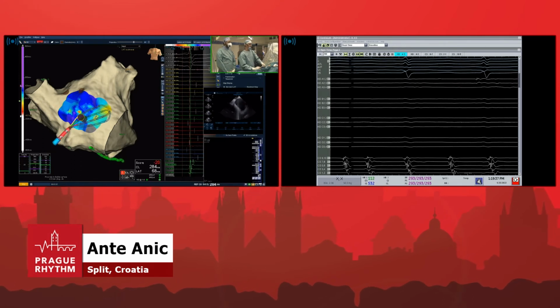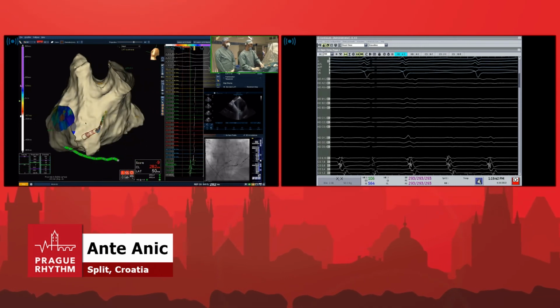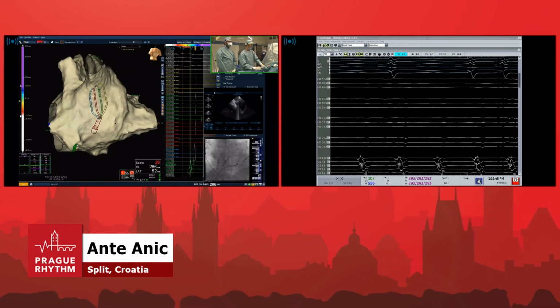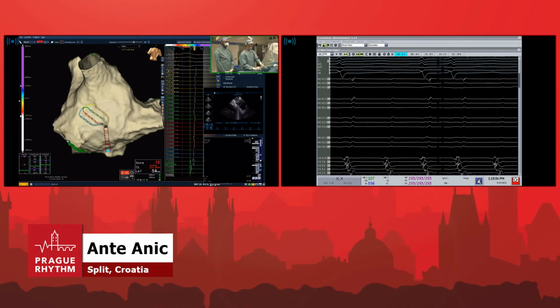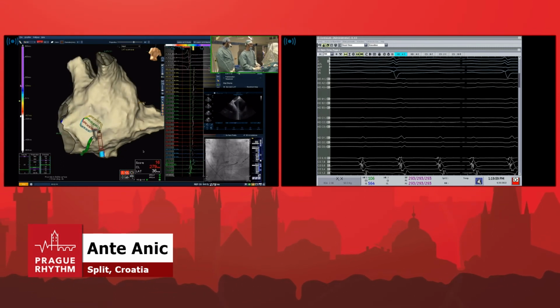So there are not too many points here to give you. Let me go to the mitral isthmus. Here. Nothing there, huh? She used to have fair signals here. Nothing here. Ablated. Posterior wall. Because now, after the ablation, there are not too many signals left.